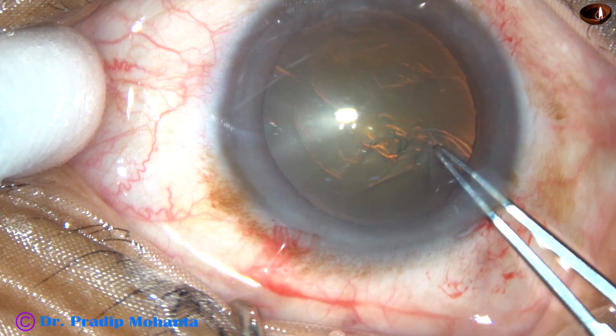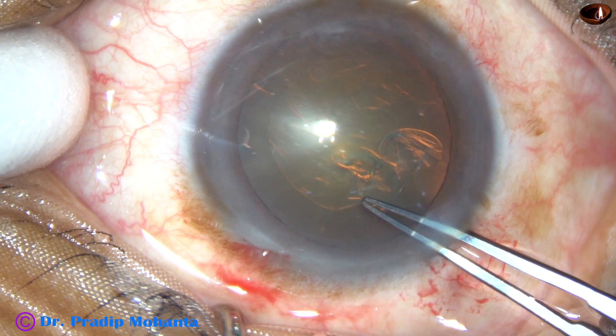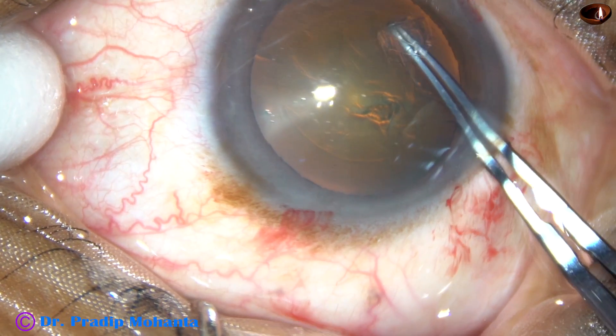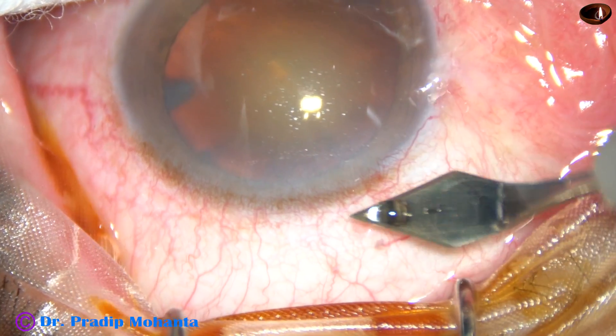In this case, the rhexis is about five millimeters in diameter. If you make a rhexis of this size, the optic of the intraocular lens will be overlapped all around and centration of the intraocular lens will be very good.